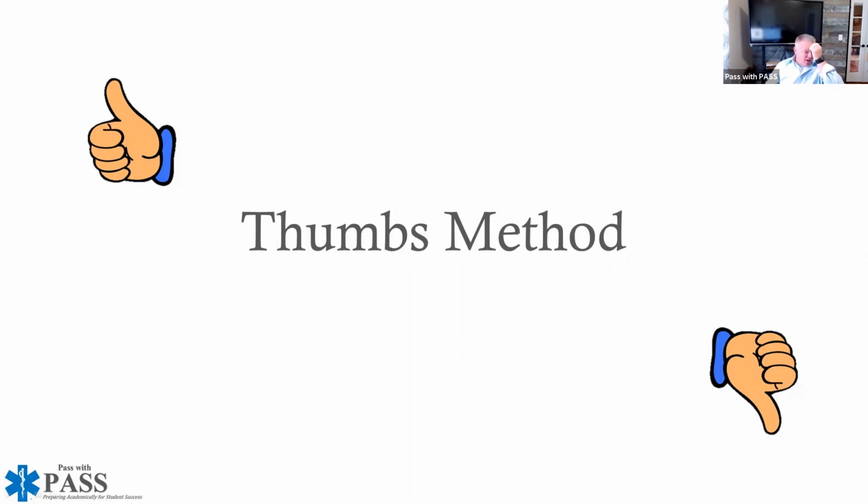The other thing here is just a rule, if you will, in air quotes. I'm going to make sure that my camera is on and you can see me. As I'm doing this, watch how I do my thumbs, and basically just put a rule to it. If we're talking about lead 1, we're always using the left. And if we're talking about lead 2, we're using the right. I'm not sure exactly how that's going to translate on the image. Hopefully it'll be right on and not backwards to you, but this will make sense as we're progressing through here. So, the thumbs method.